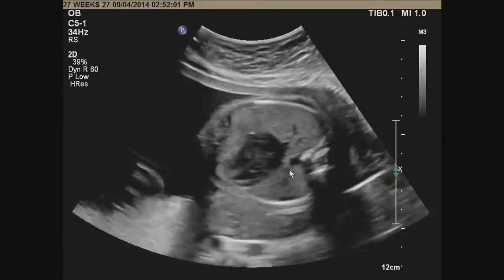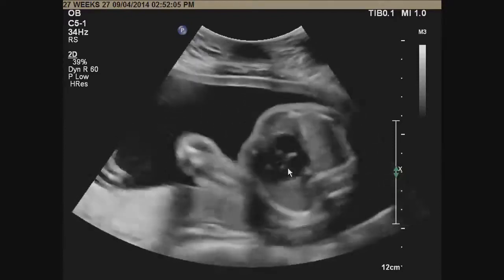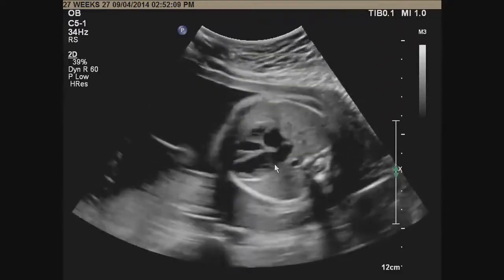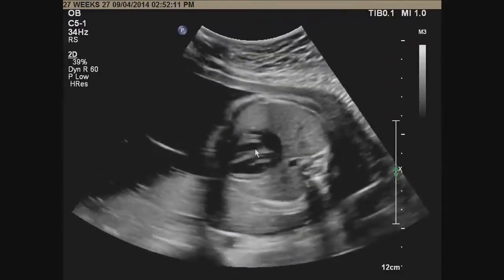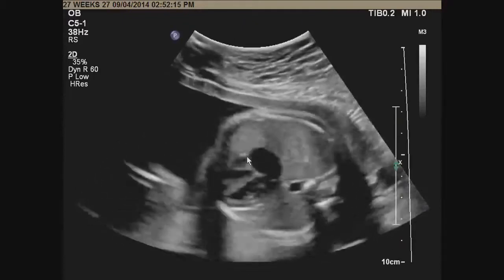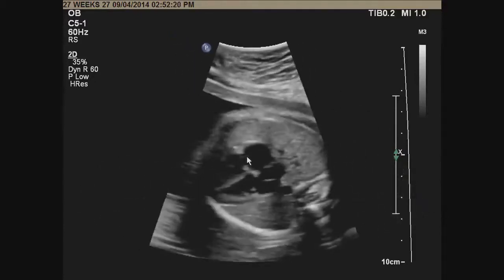So that's first orientation. Now I'm going to slide my transducer on the abdomen, and come back into an acoustic window that gives me almost a transverse view. So here I'm going to reduce the depth. Now I'm going to narrow the sector width, now that I've found a nice acoustic window to get in.